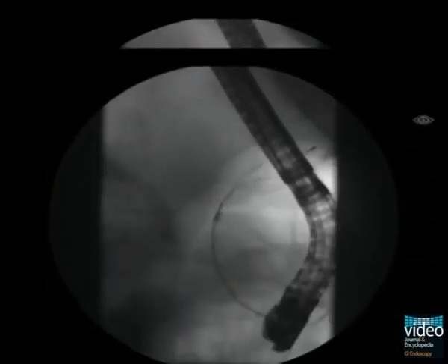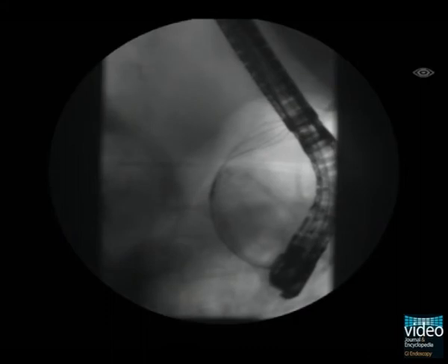Stone fragmentation is monitored endoscopically and is also confirmed by fluoroscopy with contrast introduced through the working channel. Once the large stone is fragmented, the ultra-slim endoscope is removed and ERCP is conducted. The stone fragments within the duct are then extracted with a dormia basket and balloon catheters.